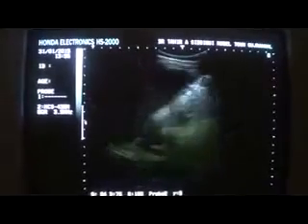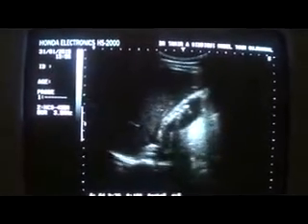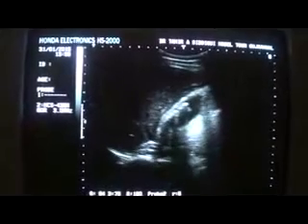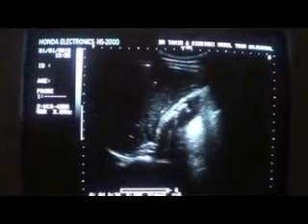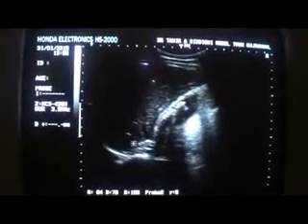Why is this the gallbladder and not some other structure? I am going to ask the patient to take a deep breath. I am in the same intercostal space and angling the probe towards the patient's left shoulder. One thing here: this is the portal vein and this is the common bile duct, not dilated.